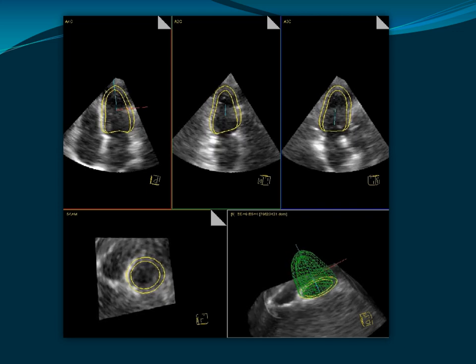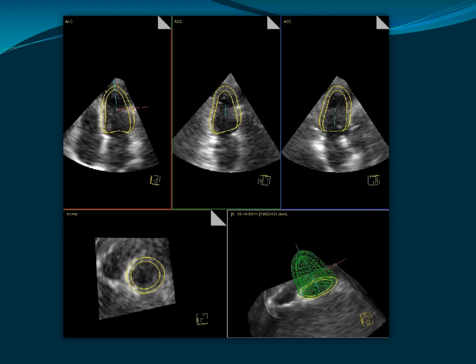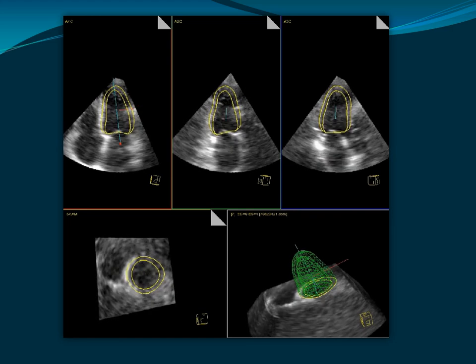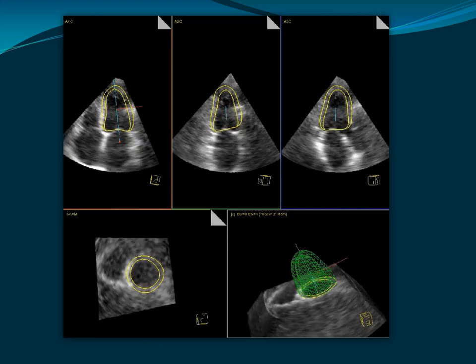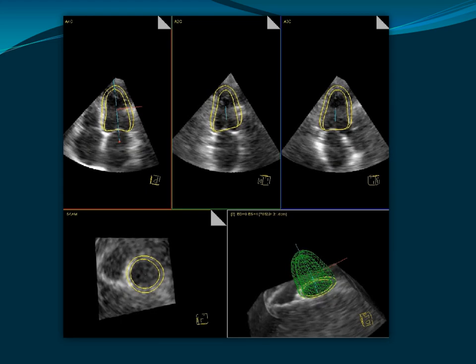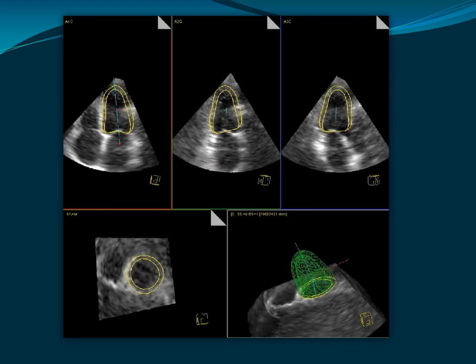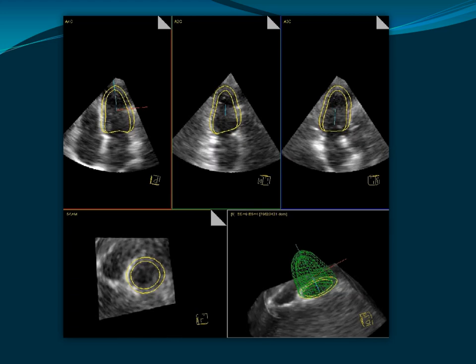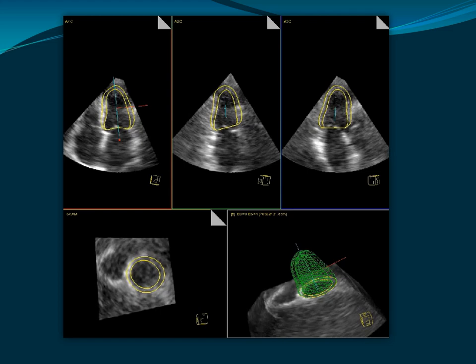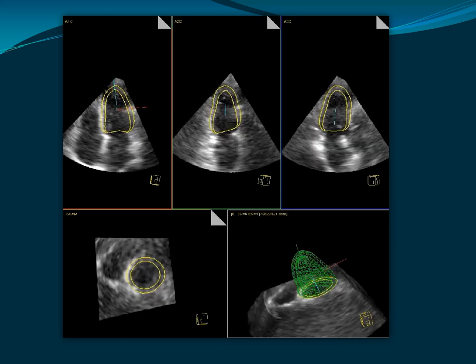What I do in my lab is, because there are differences in methodology between machines, and people come all the time and sometimes encounter a specific machine from a specific vendor, what I say to my staff is, when the patient comes and is done on one vendor's machine, he's now married to that machine, and the next time he has to be checked on the same machine, so that I don't have inter-vendor variability on top of my own intra-observer variability.